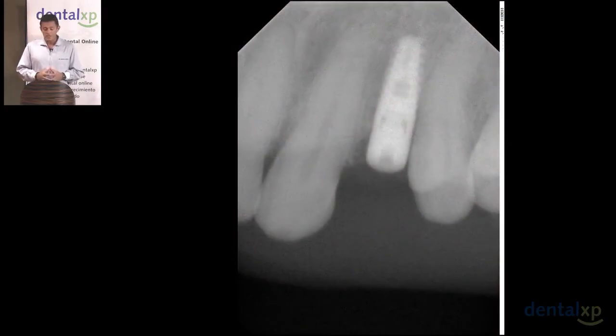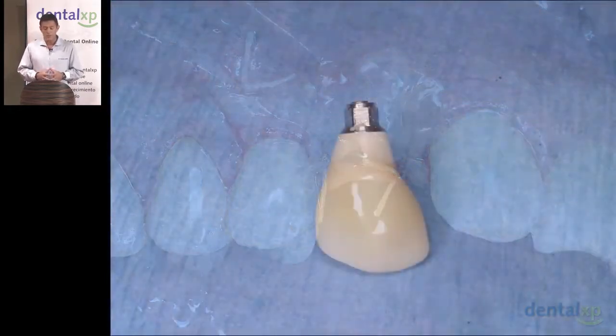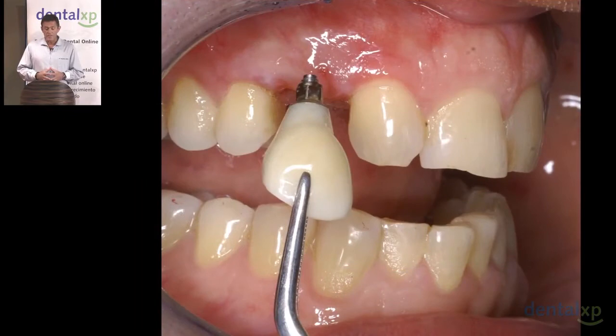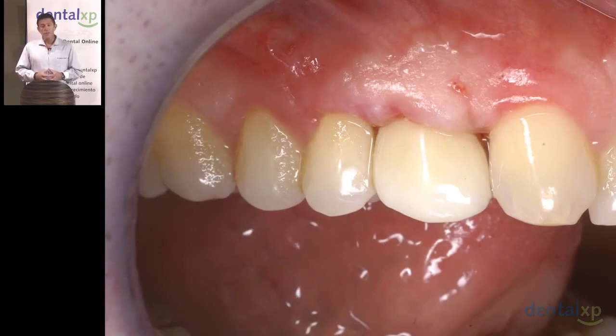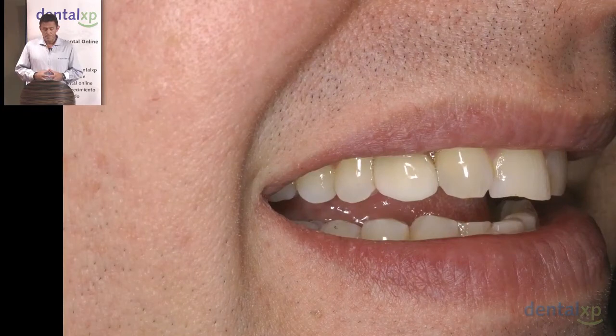Here's the implant in place. This is again a spiral design with very aggressive threads that gives us excellent immediate stability. And here is the temporary restoration on the final abutment approximately 3 days later. You can see only minimal swelling 3 days after surgery, and now the temporary restoration is in place, and the soft tissue is going to be allowed to heal around this implant that was placed immediately. Here it is with the smile. You can see we don't see the soft tissue line at the maximal smile, which allows this patient to heal around the contours of the abutment and the temporary restoration before the final restoration is fabricated.